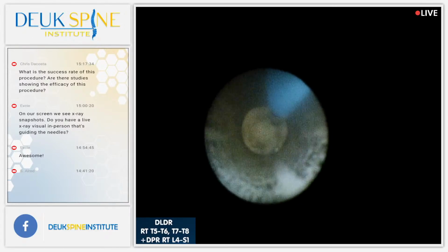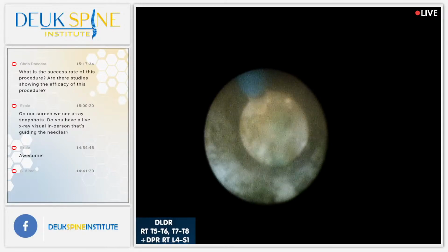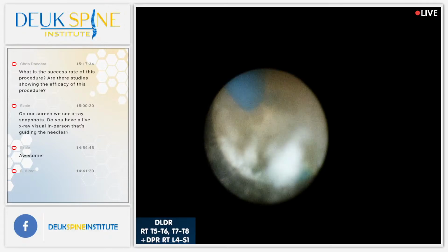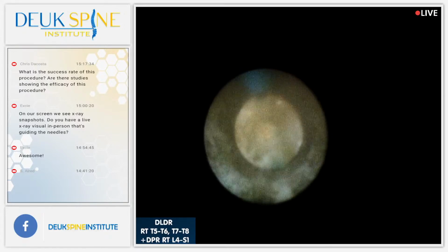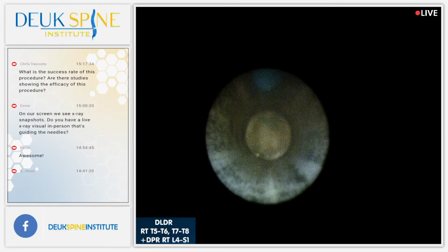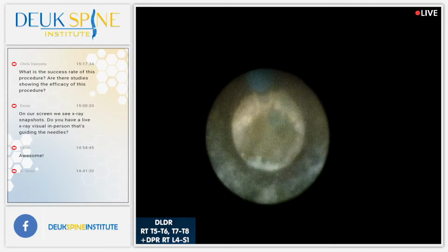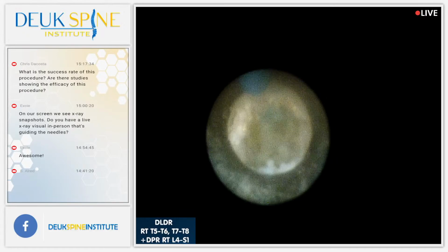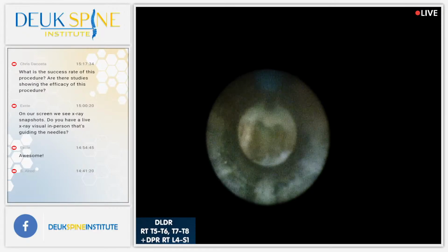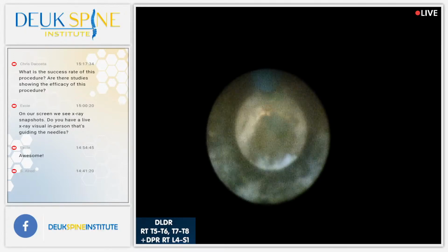So I figured, okay, for me to force the issue and try to get into 5-6, I could end up causing a serious problem for her, like spinal cord injury or pneumothorax, something bad. Is it worth it for me to continue to pursue 5-6 when her pain map clearly shows the pain is lower down, more related to the 7-8 disc rather than the 5-6? At that point I realized the risk of pursuing 5-6 aggressively, with that bone blocking it, could result in a complication. So I said, no, this is not worth it for my patient to have a complication.